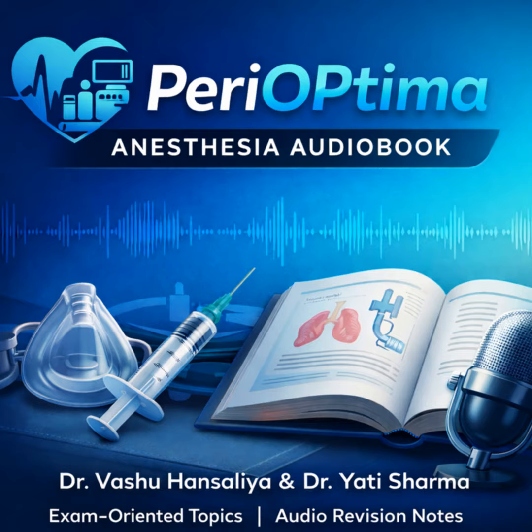The first and most important category is awake fiber optic intubation, AFOI. And this isn't just a preference. It's considered the safest approach precisely when you anticipate both difficult mask ventilation and difficult intubation, the cannot intubate, cannot ventilate scenario. If you predict that, AFOI is your primary strategy.